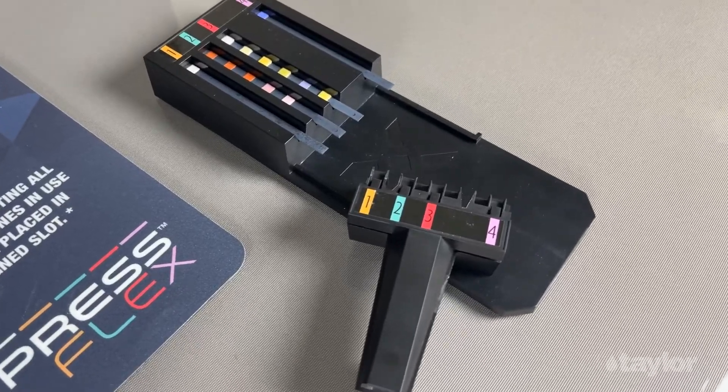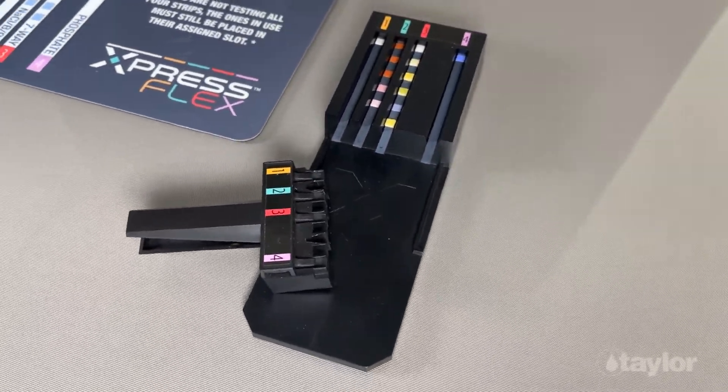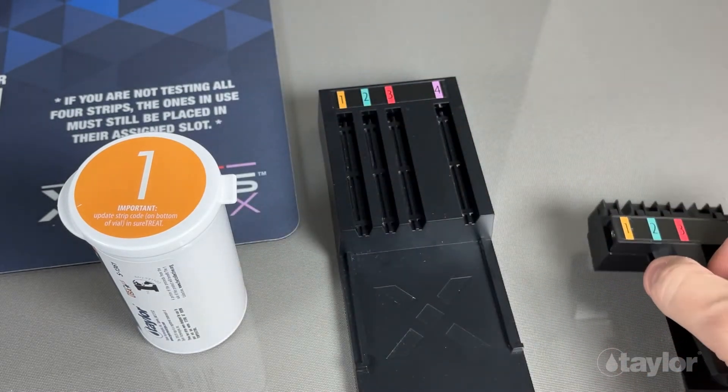The ExpressFlex strip loader makes the process of adding test strips to the strip clip simple, and ensures the test strips are aligned for accuracy when the test is performed. Please follow the matching labels on the strip loader and strip clip.